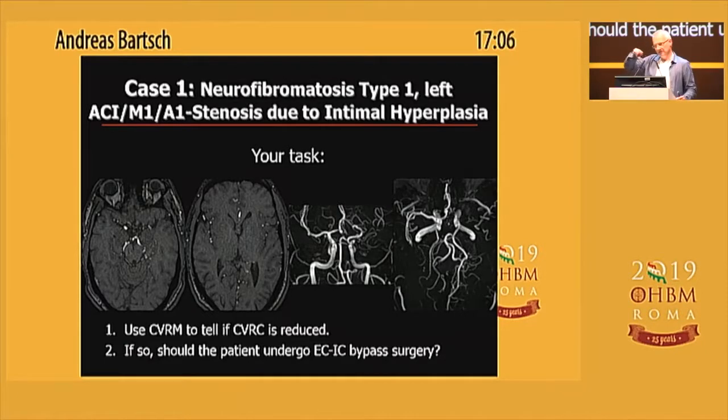So the intima of the arterial vessels gets hyperplastic. Only in 10 to 15% of the cases, so that doesn't happen with all of the patients with neurofibromatosis, but this constellation of Lisch nodules with this missing flow void is quite typical. And you see, again, the missing flow void and the missing contrast in the terminal carotid in the time of flight angiography here.